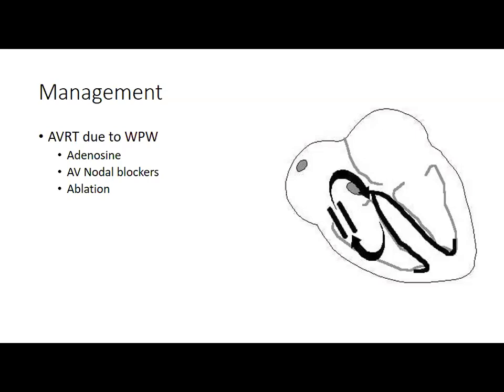So don't be afraid to say SVT. It's impossible to tell AVNRT or AVRT without a ton of experience. But please familiarize yourself with what SVT looks like and how to manage it. It's very similar between AVRT and AVNRT.